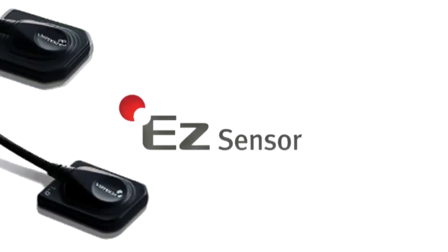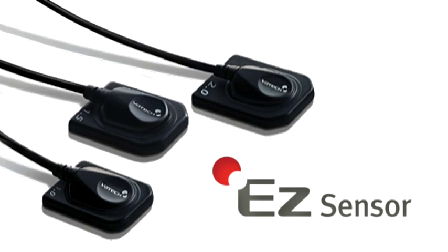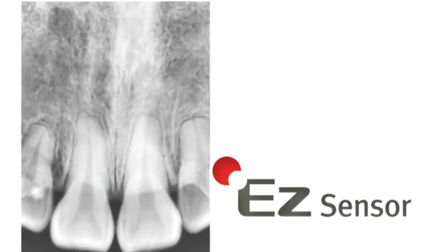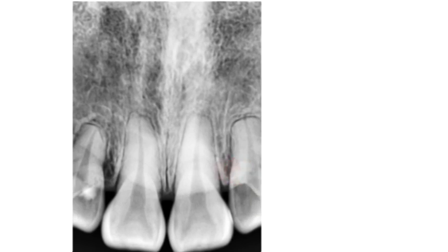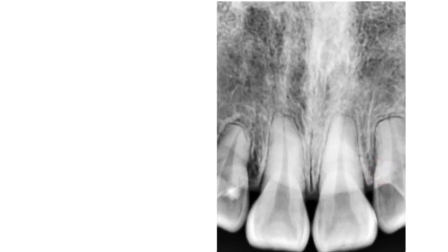Introducing the EZ-Sensor intraoral sensor from Vatec America. The EZ-Sensor allows you to easily capture high quality radiographic images while yielding the most advanced intraoral diagnostic capabilities.